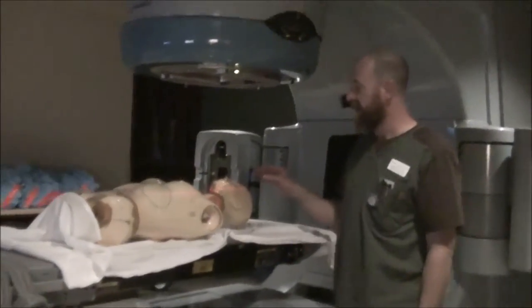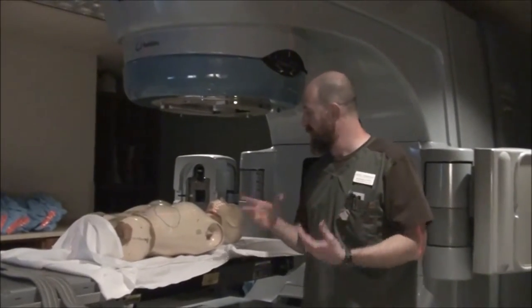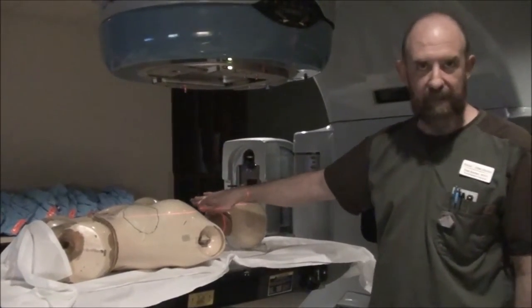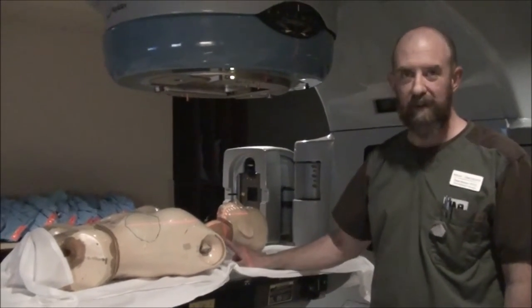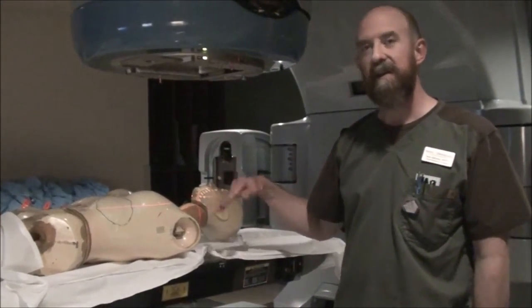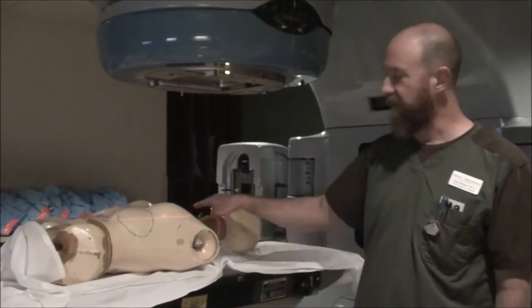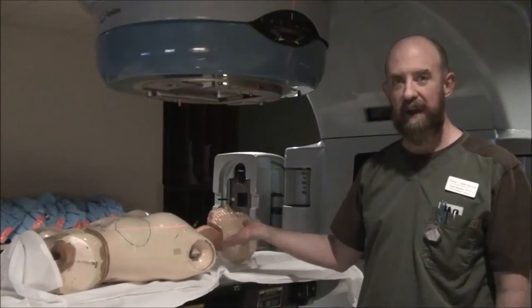As we discussed in class, the ballpark for larynx — the relative borders — is you're going to go from the top of the thyroid cartilage to the cricoid cartilage. Anteriorly, you're going to have about a centimeter or two of flash. Posteriorly, radiographically, you're going to either go to the top of the vertebral bodies' anterior surface, or split the vertebral bodies.